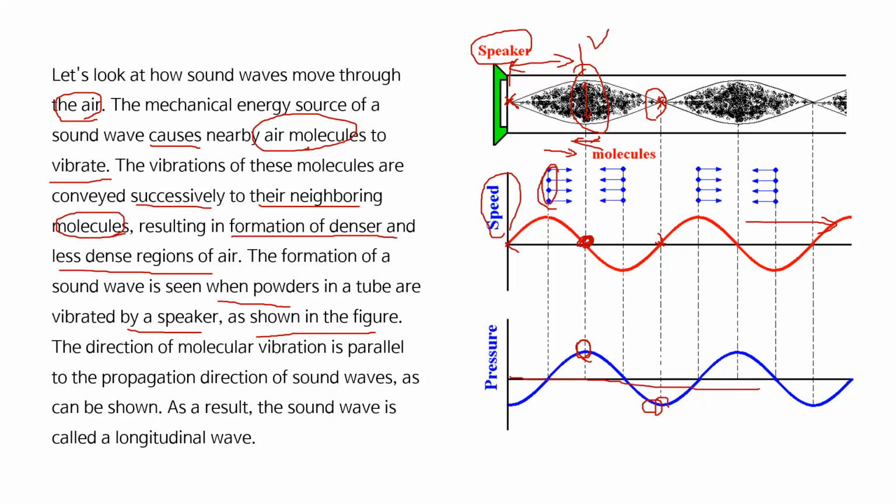It shows lowest value and highest value, and these patterns continue through the medium.